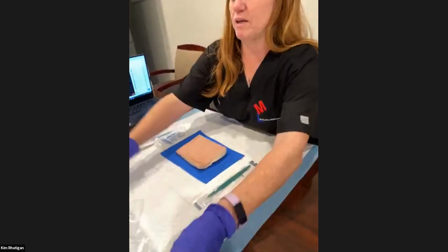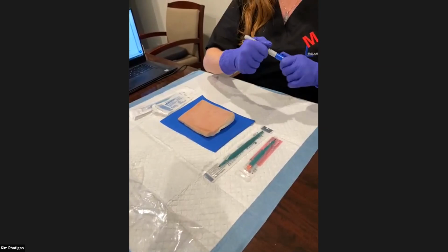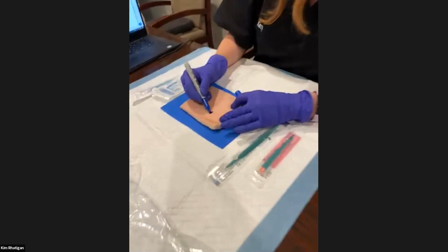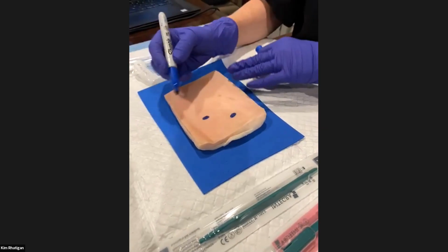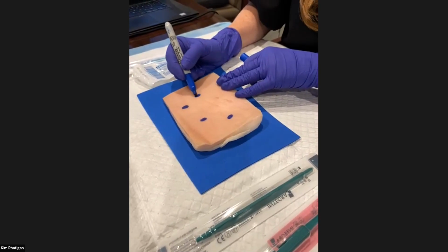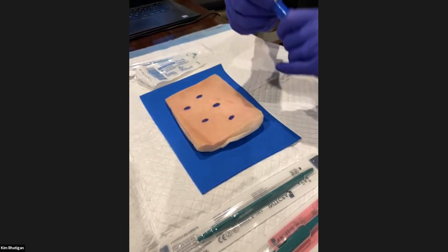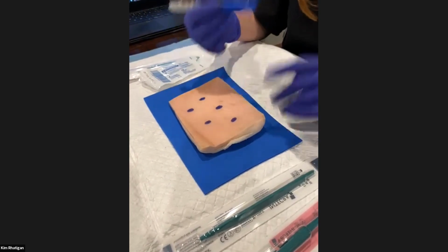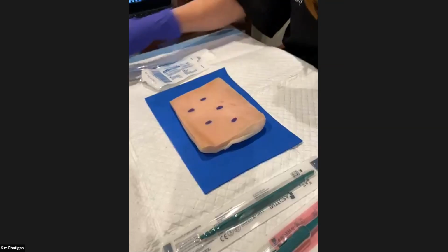Okay, so let's begin. What I'm going to do also, I'll give you a moment, if you have a Sharpie, I like to draw some figures on my pig skin. There's a couple of pieces of pig skin in your packet, so you could use one now, save one for later, and practice at your leisure. If you don't want to use the pig skin, you can use an orange, a potato, anything other than a human being you're welcome to use.